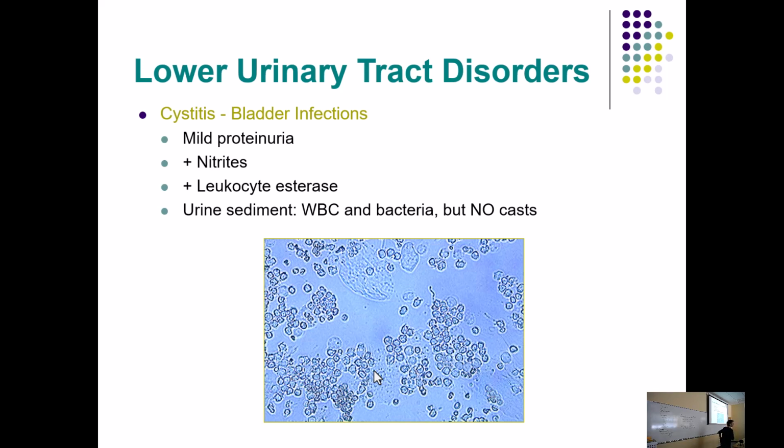Is that a trichomonas? No. Oh, no, they look like little mice. Do they? Yeah. Kind of fun. I used to be able to get trichomonas from UW Hospital and bring it in and spike some urines, and they don't have live trichomonas anymore, so I can't do it. And it's really expensive to buy for one lab because I looked into it. I'm like, oh, I can't do that anymore. Wow. We'll show some videos with it. We'll have some videos.